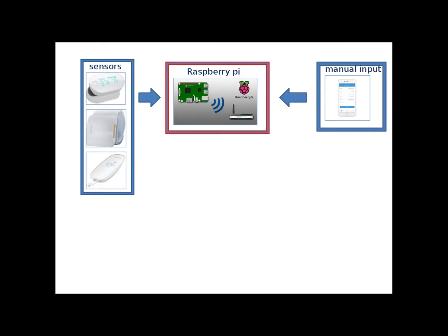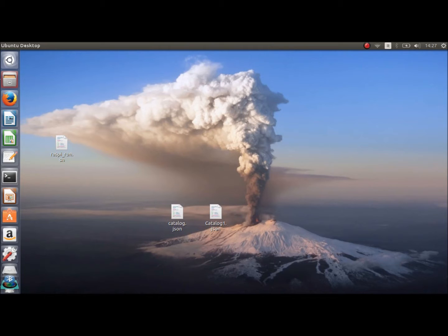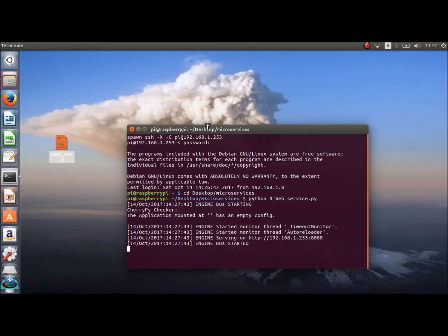Patients send measurement data through their iHealth sensor or using manual input mode. The Raspberry Pi receives them, processes them and gives output that can be accessed through the web service. The Raspberry Pi will work as a remote server, so we just run an executable file from our laptop. This will connect to the Raspberry Pi via SSH shell. The Raspberry Pi has a static IP. It changes directory and runs the web service Python script. From now on, we can control our program from the web service.